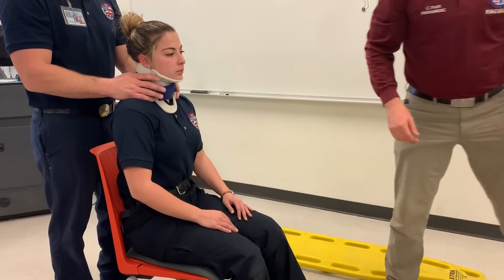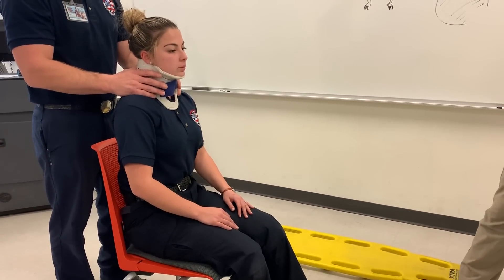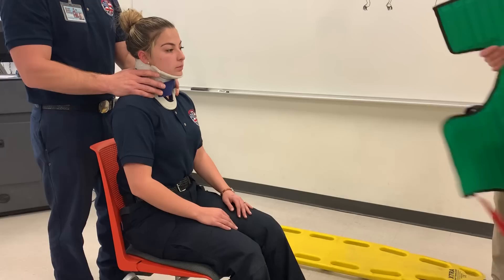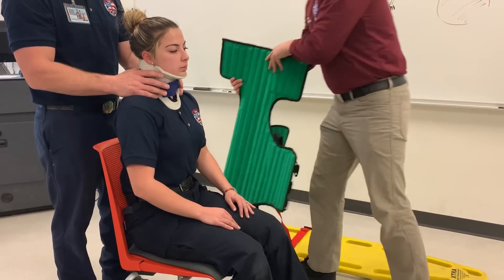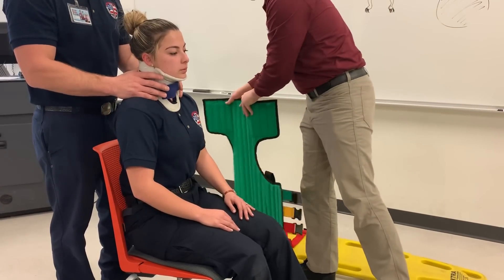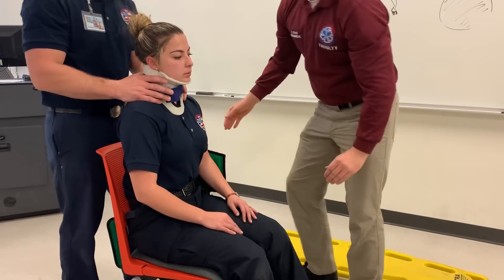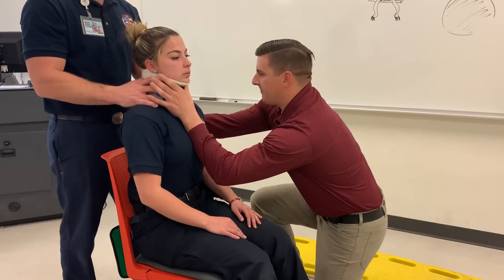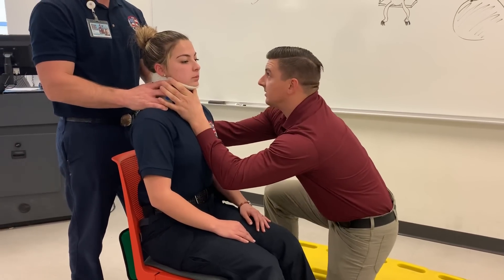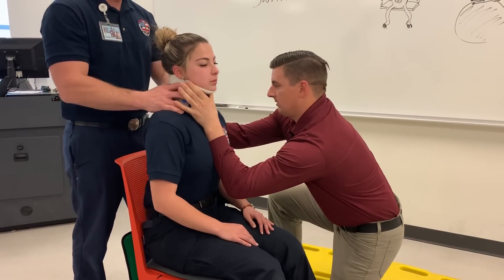Now that the C-collar is secure, I'm going to get my KED device over to my partner and prepare to tilt the patient forward. I'm going to go on the head man's count and tilt the patient forward. One, two, three.